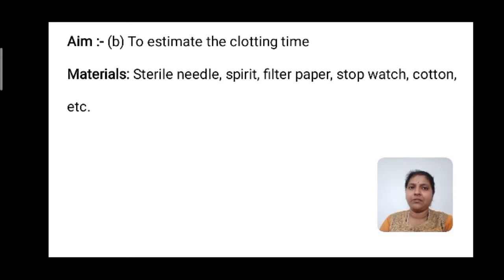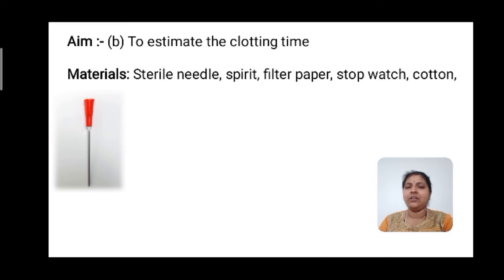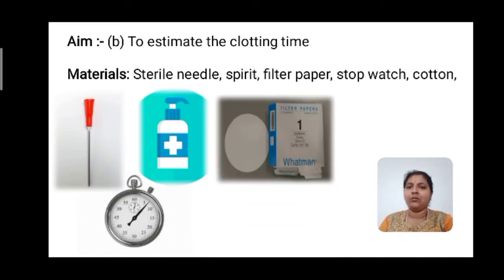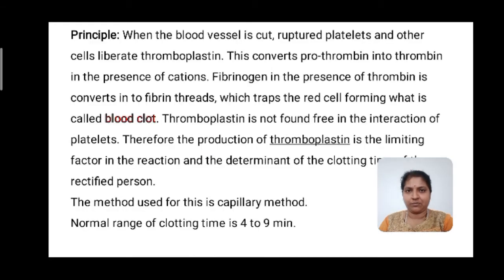Now the second part, to estimate the clotting time. The material required is a sterile needle, spirit, filter paper, stopwatch and cotton. Now the principle behind the practical.